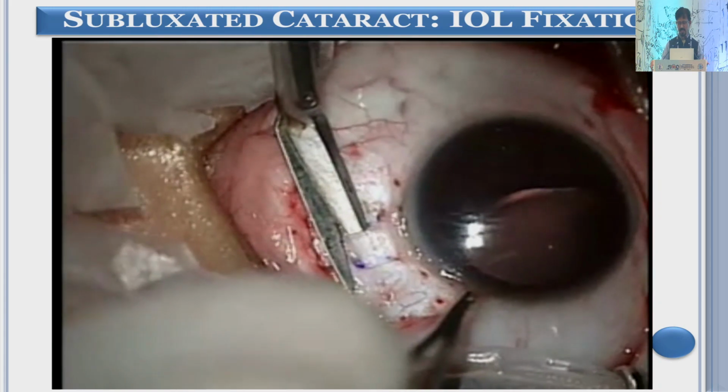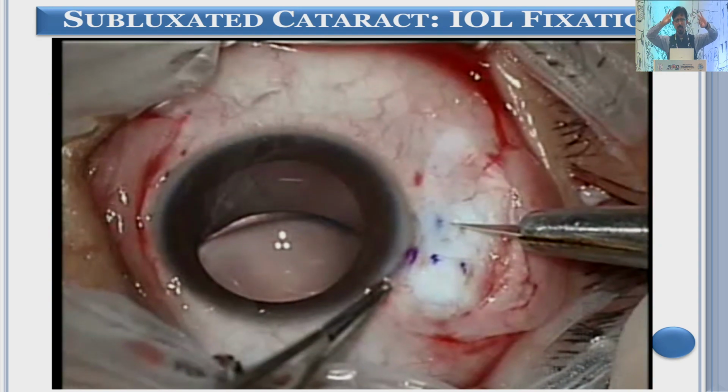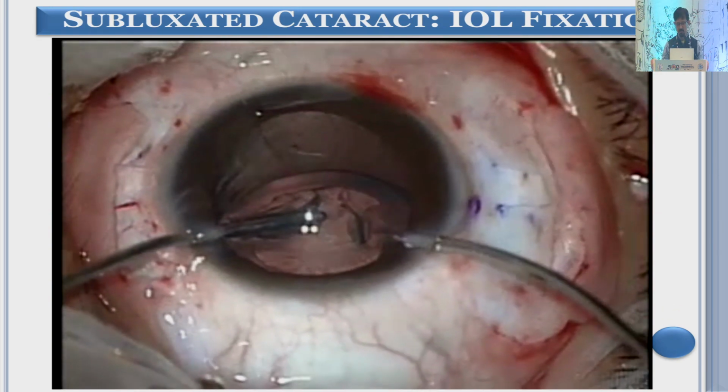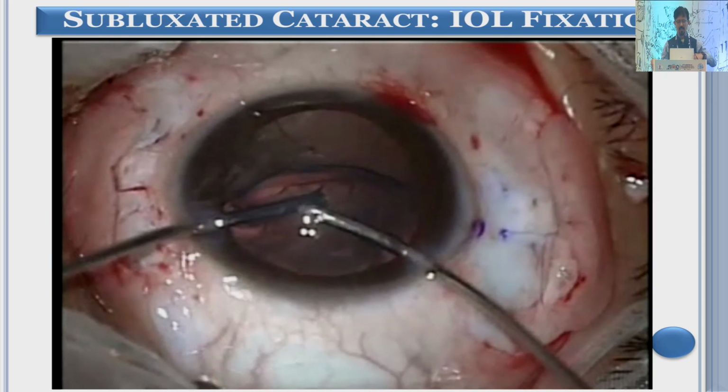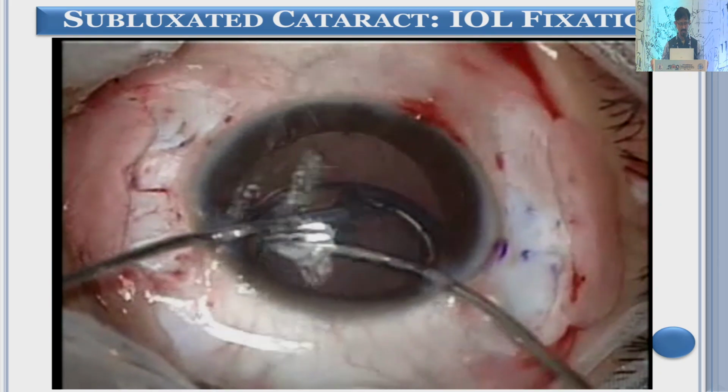It is absolutely negligible. But with suture fixation, you fix at 2 points. So with the movement of the eyeball, the lens also moves quite a lot. We did a UBM study and we found out. So in these cases, if it's a young individual, you can just do intralenticular lens aspiration.